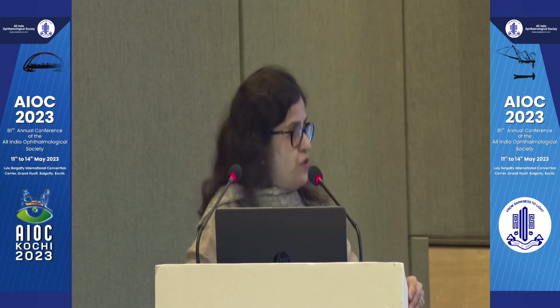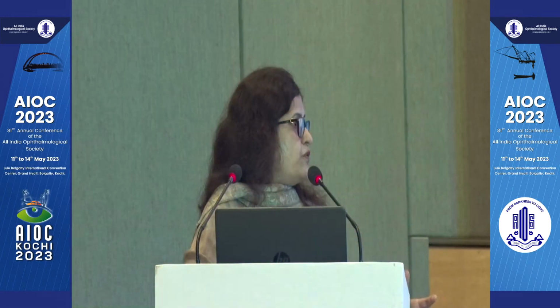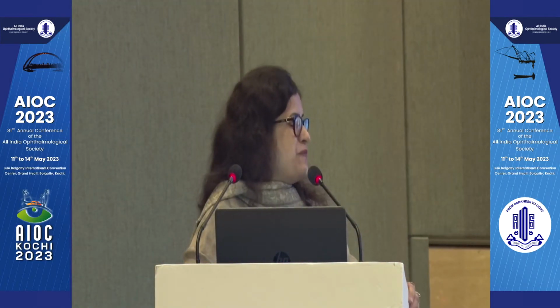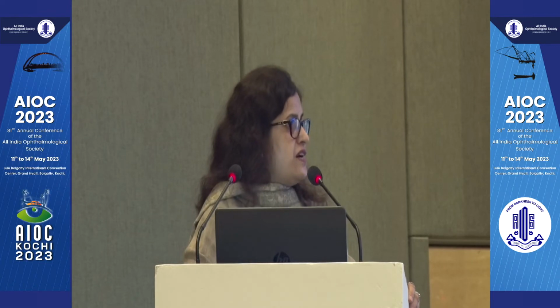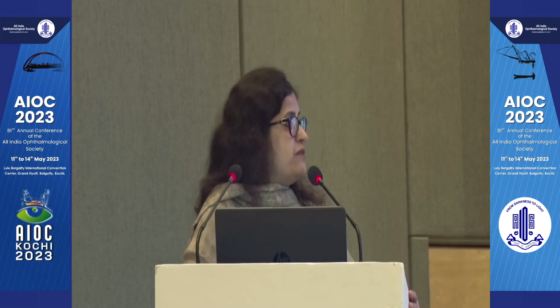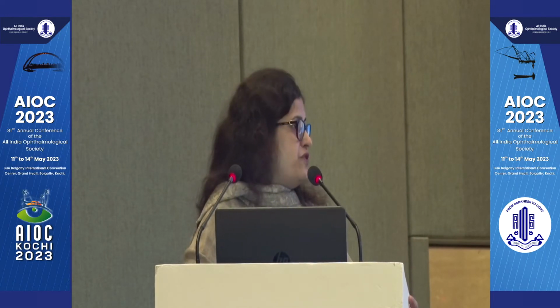Hands-free gonioscopes, because it may sometimes be difficult to use all your four limbs, like both the hands, with the phaco probe and the microscope foot pedal on. For the beginners, I would say if your one hand is free, then you can have better manipulations. But I think with practice, it doesn't make that much of a difference.